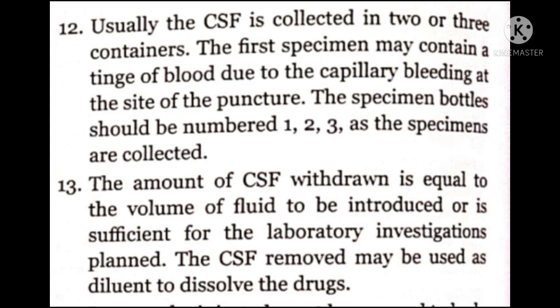12. Usually the CSF is collected in 2 or 3 containers. The first specimen may contain a tinge of blood due to the capillary bleeding at the site of the puncture. The specimen bottles should be numbered 1, 2, 3 as the specimens are collected.